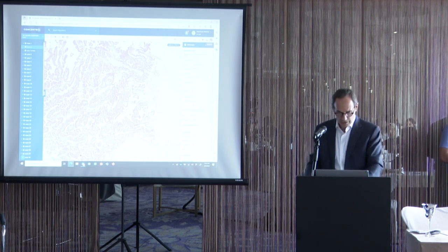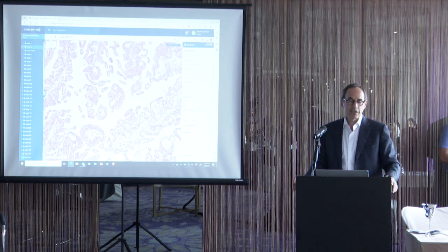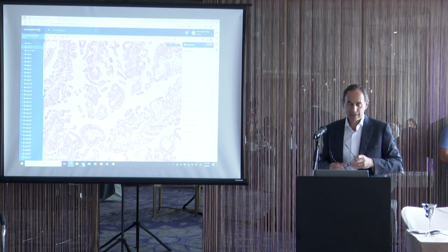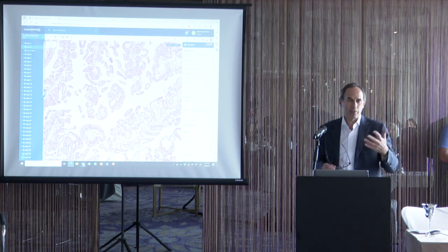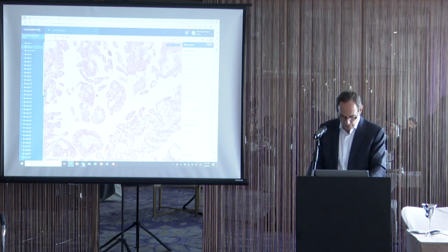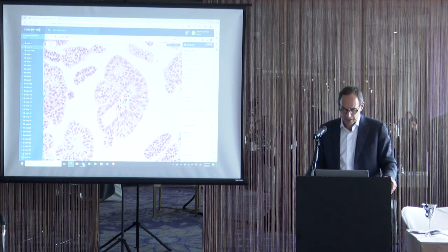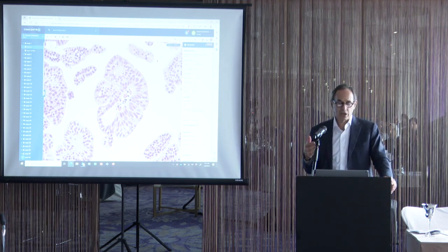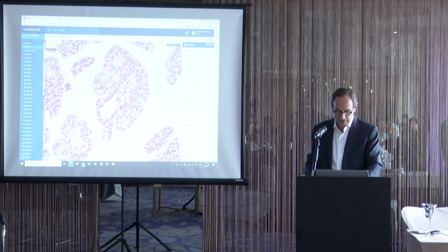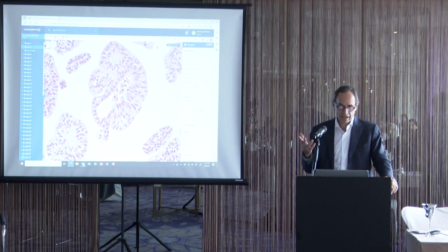Most of these are just not very specific, so ultimately we have to rely on the pathology. So what we see here is a papillary lesion, very striking papillary lesion. As I mentioned, usual prostate cancer doesn't typically have a papillary pattern to it. That's not one of the classic patterns of prostate cancer. When we look at the cytology of these papillary fronds, again, it's not the typical cytology of usual prostate cancer. These are very pseudostratified, they're columnar epithelium. That's a classic finding of prostatic ductal adenocarcinoma.